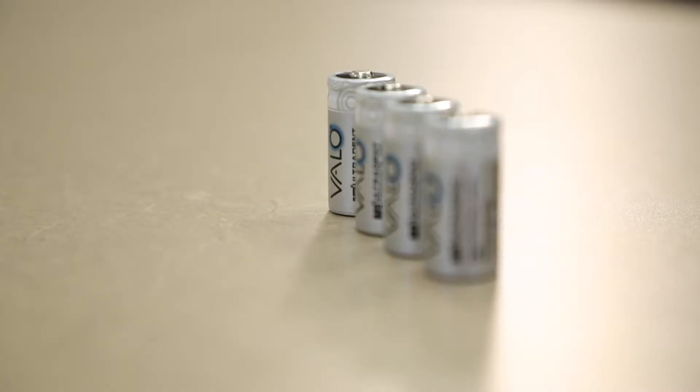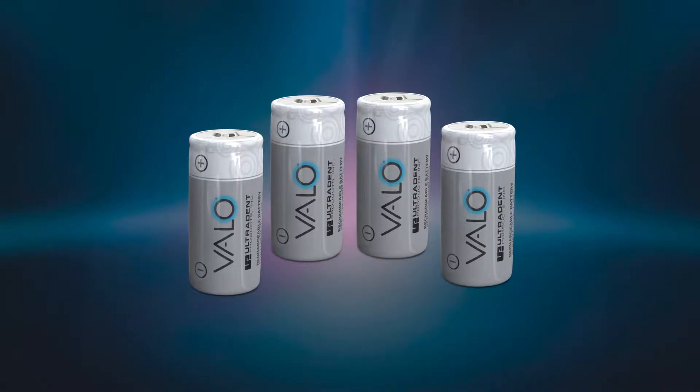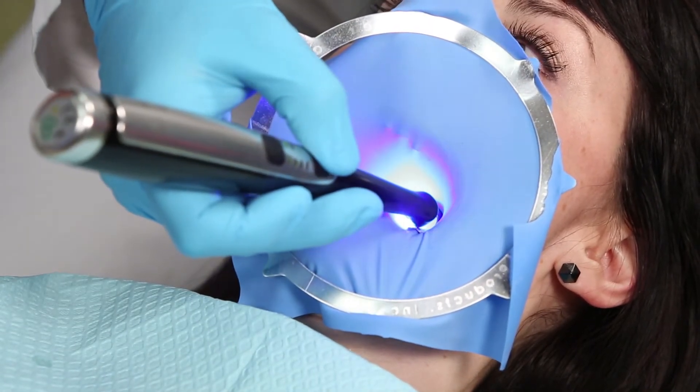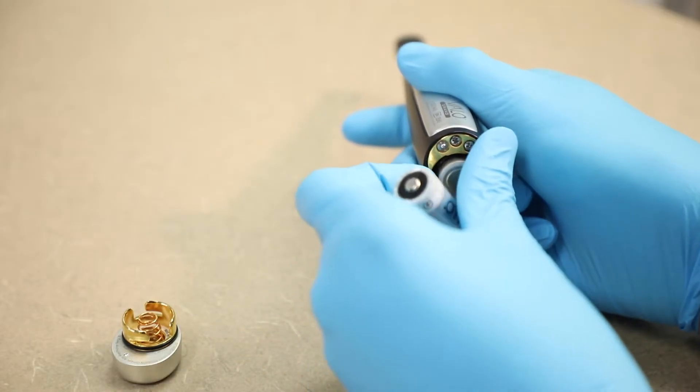The curing light comes with four rechargeable batteries. Rechargeable lithium-ion phosphate batteries can be recharged repeatedly. Based on normal use and proper care, the battery should last a few years but should be replaced as necessary.